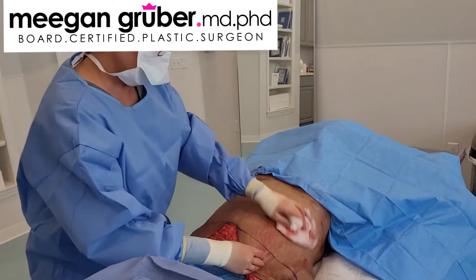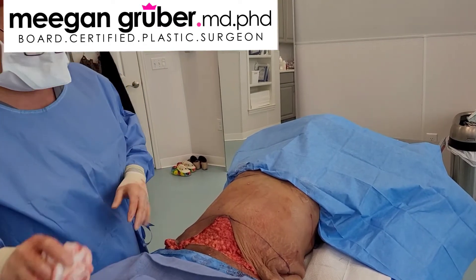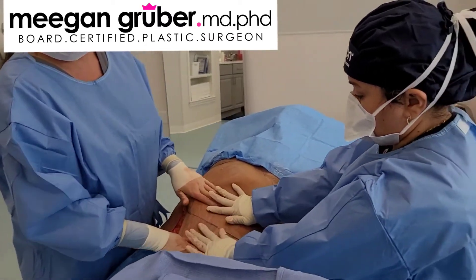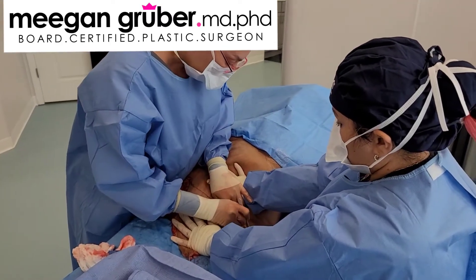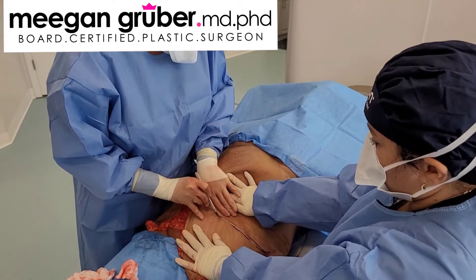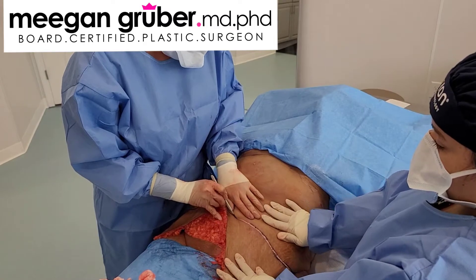So I'll bring my assistant back in and we will go ahead and pull this this way and remove it. Are you doing good under there? I am. You're doing the work — I'm just holding the thing.